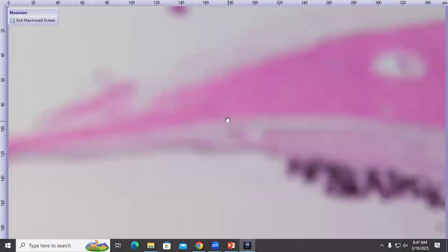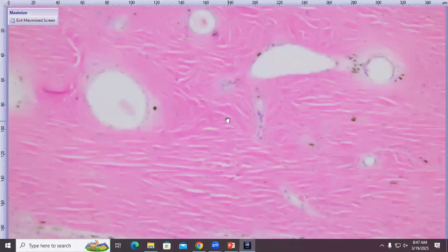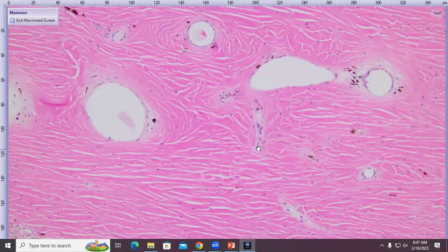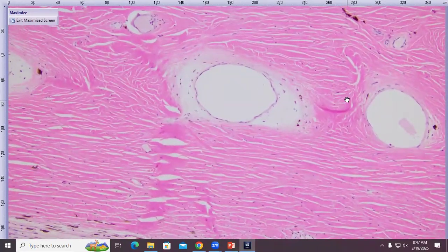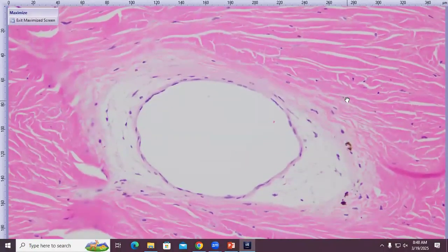If we walk this a little ways over into the sclera, let's take a closer look at these vessels of the scleral venous plexus. You can see that around each of these vessels, or at least many of these vessels, there's this sort of halo of poorly staining matrix, myxoid-like matrix is what we tend to refer to it as. This is a fairly repeatable finding around the quadrants of the globe. So basically, we don't have a clear structural histologic cause of glaucoma. The angles look open and well-formed, but we do have this weird matrix deposited around the vessels in the scleral venous plexus. And what this presentation is most consistent with is feline primary open-angle glaucoma.